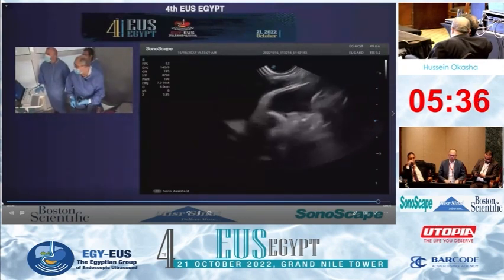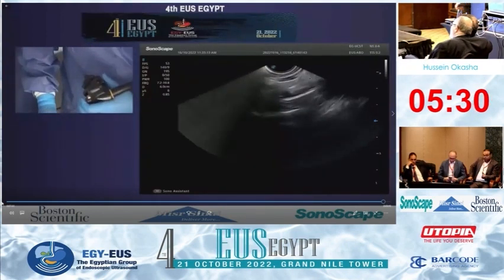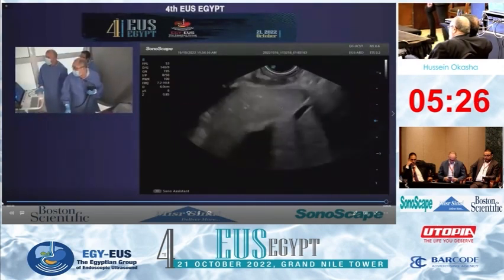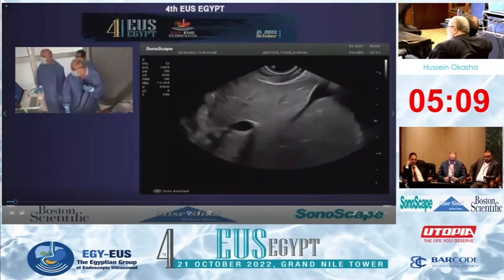Yes, when I withdraw the common carotid, I can expect to see the thyroid gland. Yes, this is the thyroid gland, very nicely seen. And here, so we finished examination of the mediastinum. Okay. Now coming to examination of the liver, the normal liver.